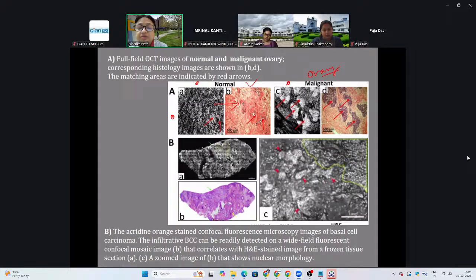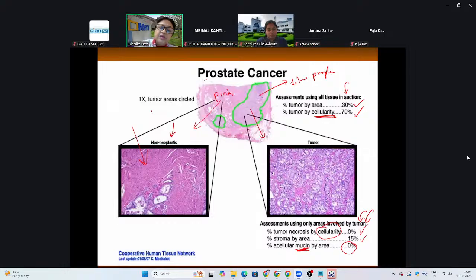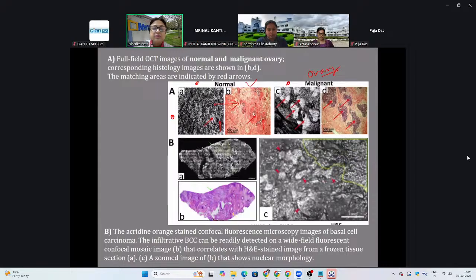Can you identify the T cells circulating in the blood? You cannot see them. Can you identify the fibroblast? That's another story. But remember, this is the core of the tissue. It is on the inside here, and it's not on the edge. So I hope I was able to answer your question.